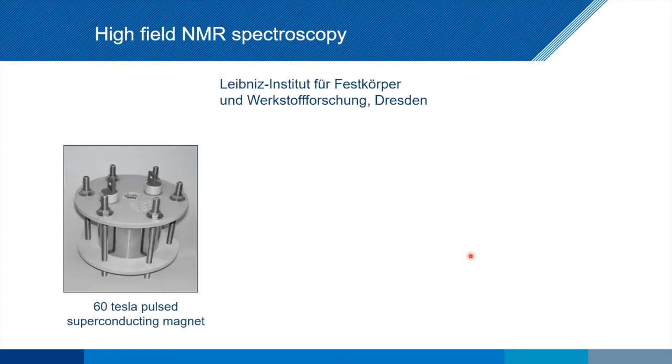But when we talk about high field, I've said, okay, we're looking at 21, 22 Tesla, something like that. Let's really go to really high field. Let's push it as far as we can. And this is work that I was doing with the Leibniz Institute in Dresden, full of some completely and utterly insane German and Russian chemists there. And essentially what they had here is a 60 Tesla superconducting magnet. So we're going to do 60 Tesla MR.